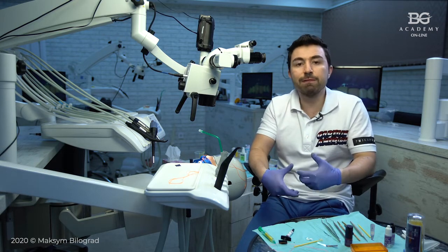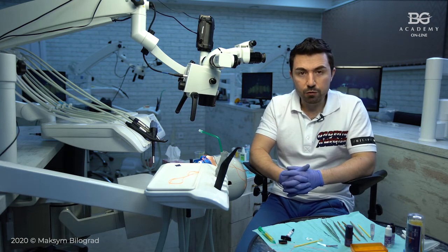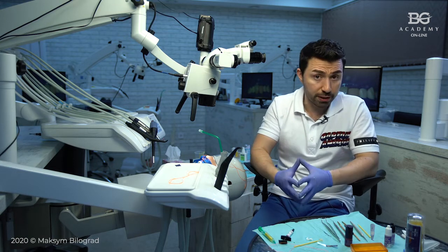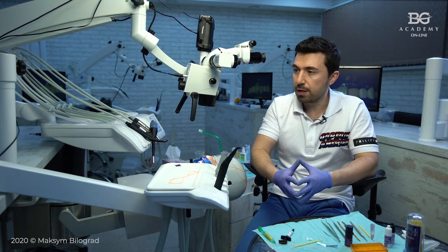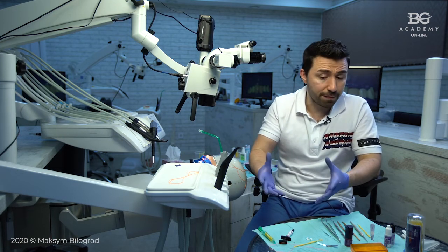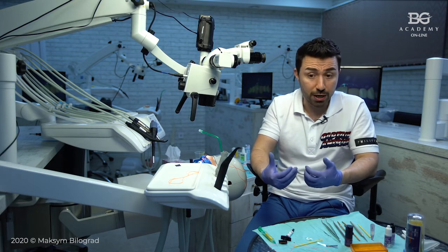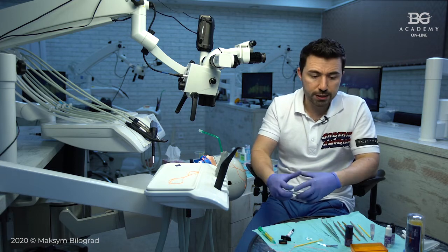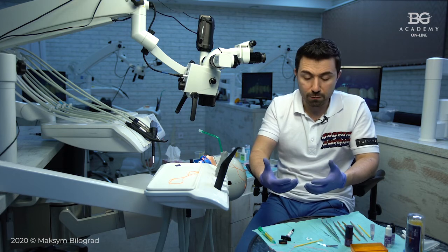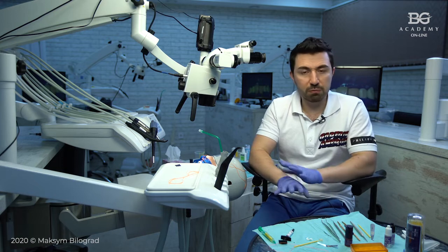You can use highly filled flowable composite. This is a nice group of composites that the manufacturer recommends to use as final restorative materials. For example, for restoring class 1, class 2, class 3, class 4, class 5 cavities, as final restorations. That means this material is filled enough to resist occlusal forces and the environment, to be stable in terms of the wear process, and also color stable. So these materials can be used easily.